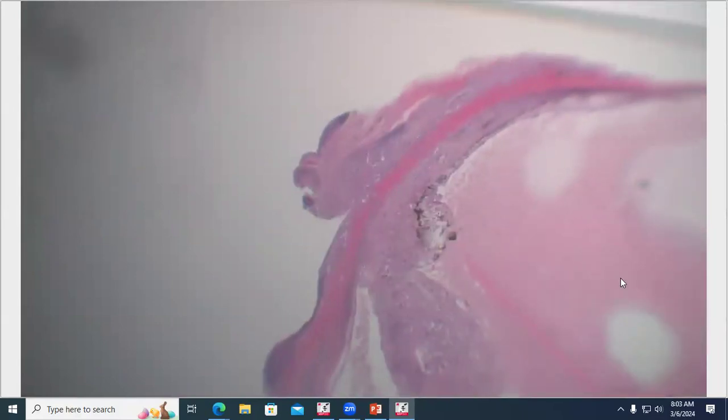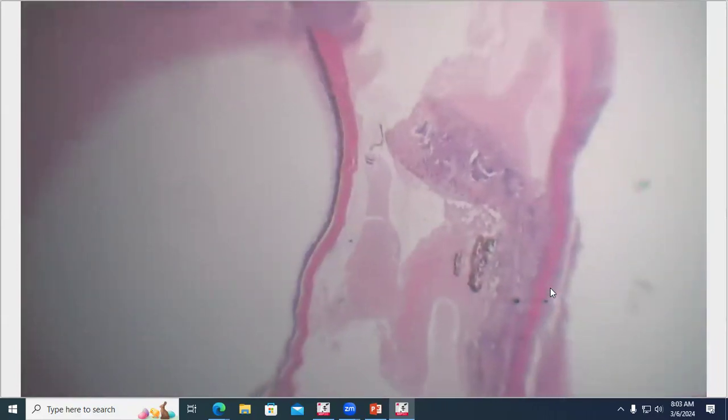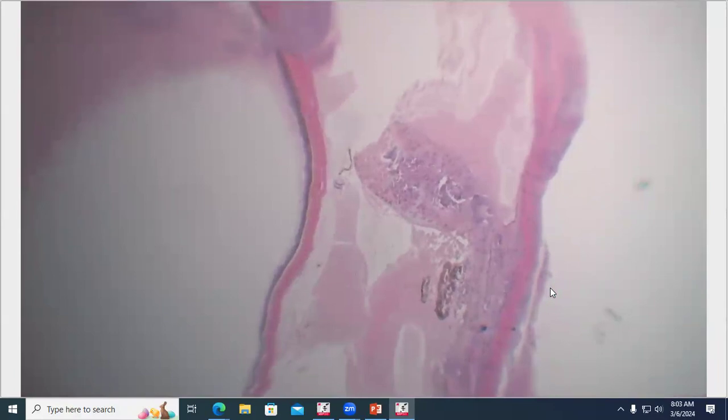It looks like there's something similar happening in the episclera here. And then when we move back to the retina and the optic nerve, similar weirdness is happening in the optic nerve and the retina. And then here's our extra gonio slice with similar stuff happening. So there's a pretty extensive disease process in this eye.